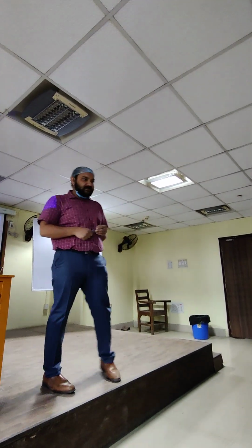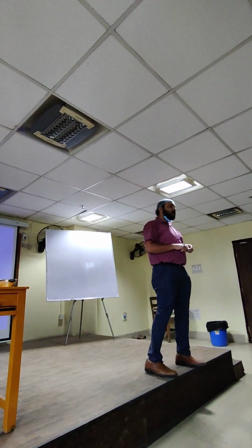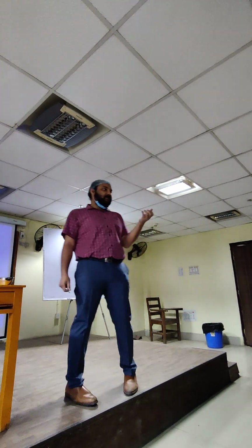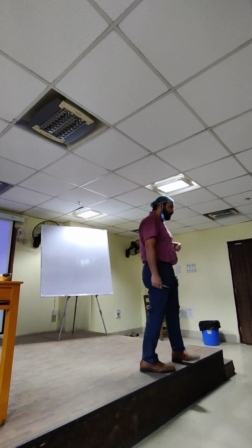Lower premolars mainly can be used. Advantage is we will not have to cut the bone. Disadvantage is there can be fracture of the alveolar bone. Uncontrolled force may be applied here.